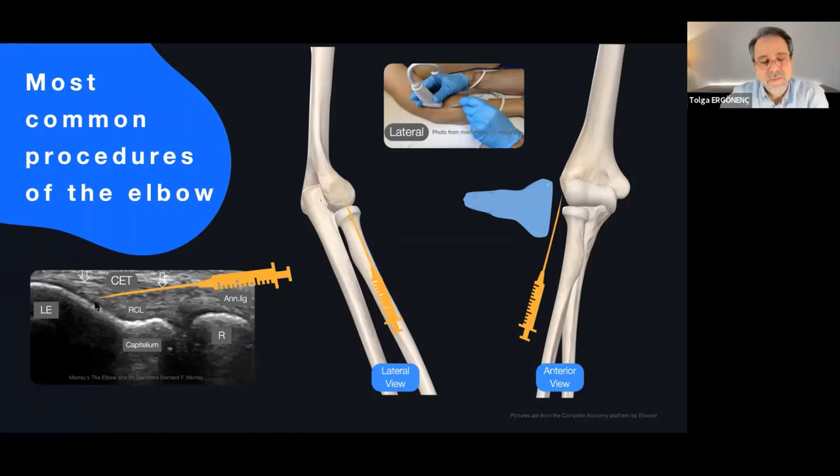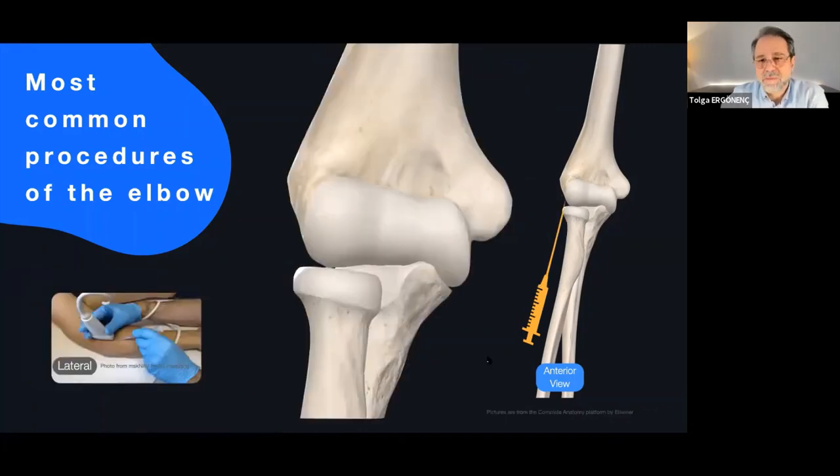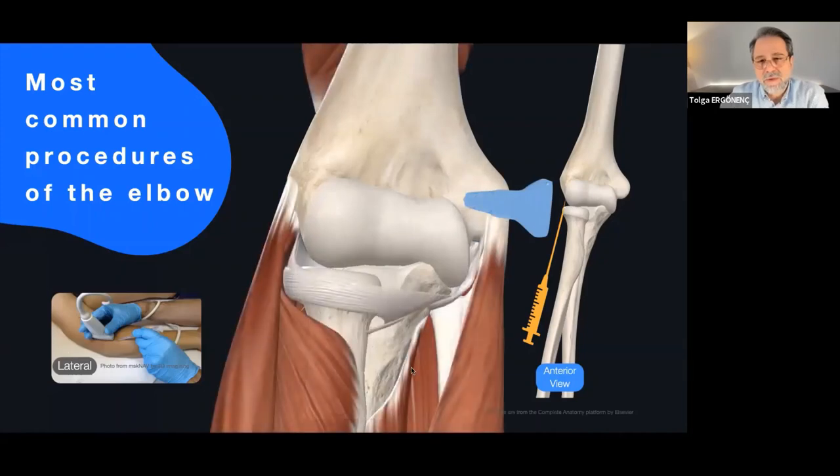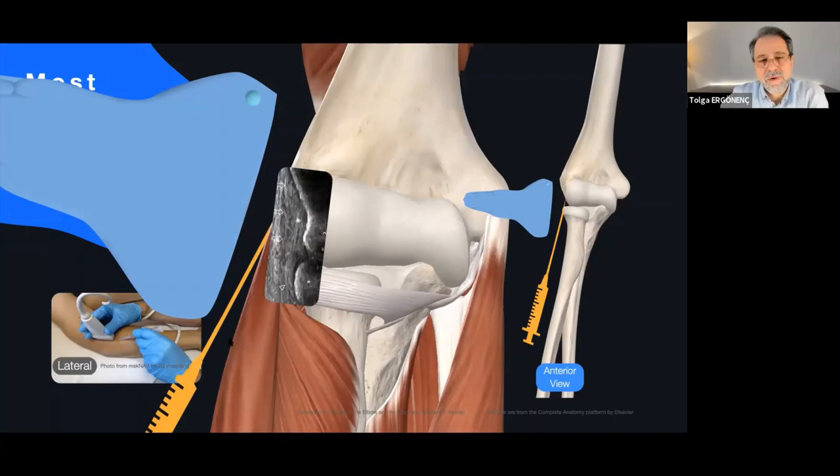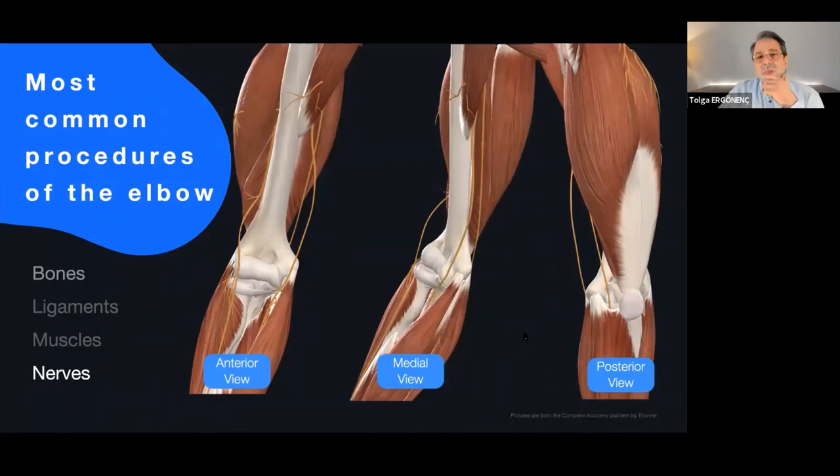When you put your transducer on the lateral side and look at this sonogram, you can perform the procedure in-plane approach. You can see the humerus, radius, and tendons attached there. So we have talked about extensor and flexor tendon procedures. Another important procedure about the elbow joint involves nerves. You need to know three important nerves: the radial nerve, the median nerve, and the ulnar nerve, approached from anterior, medial, and posterior views.